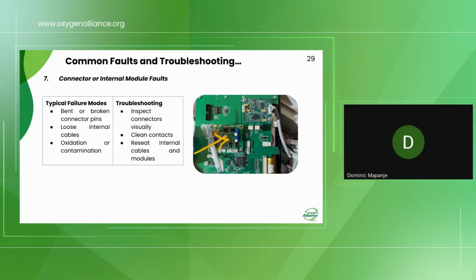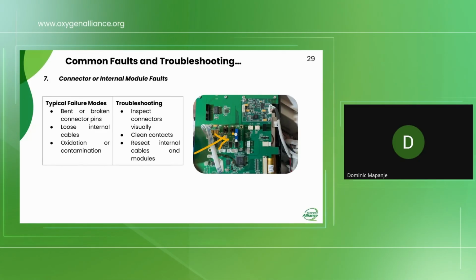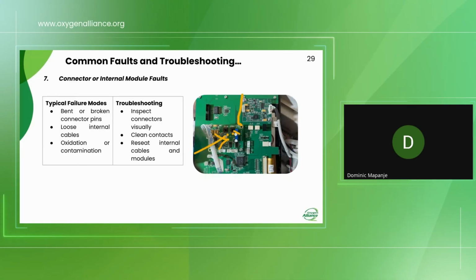That's the NIBP module. You can see the two pressure sensors, and this one is the SpO2 module.